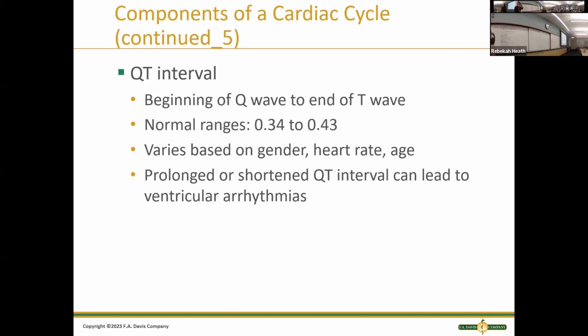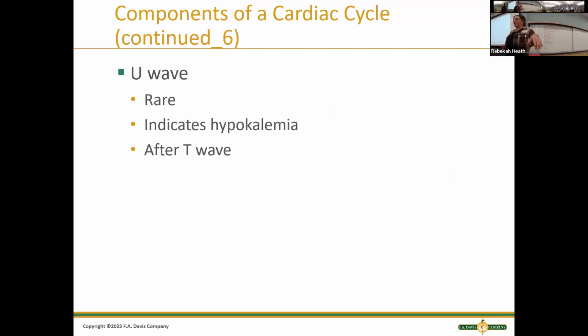All right, the QT interval. I'm not going to talk a lot about it. We're really not going to measure it. I just want you guys to know the QT interval is from when the QRS starts till the end of the T wave. If your T wave gets longer and longer, we get worried about that because it might cause arrhythmias. We're not going to measure that today. We don't have to worry about QT intervals.